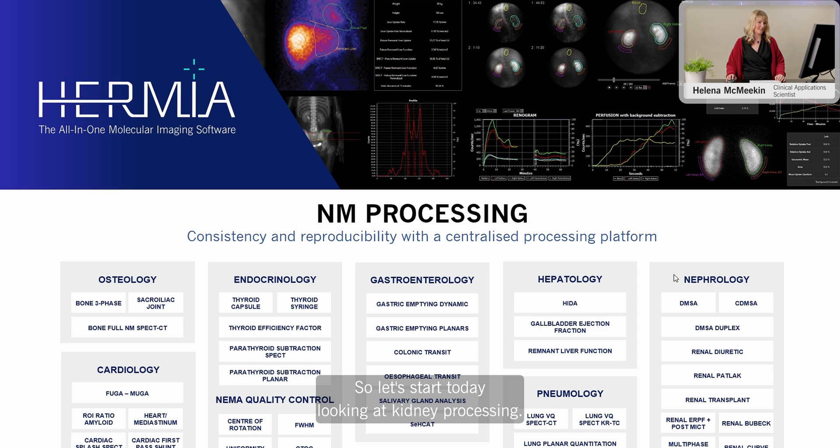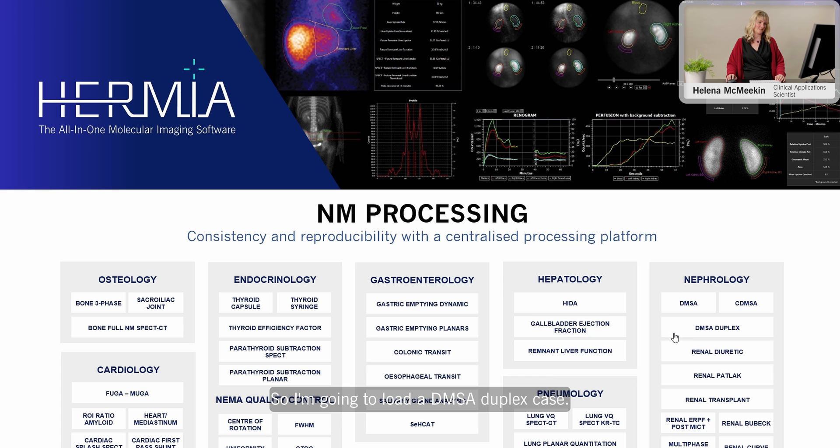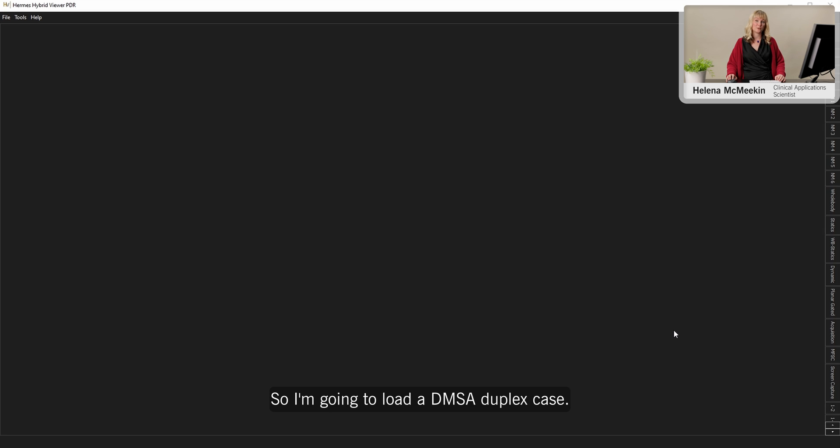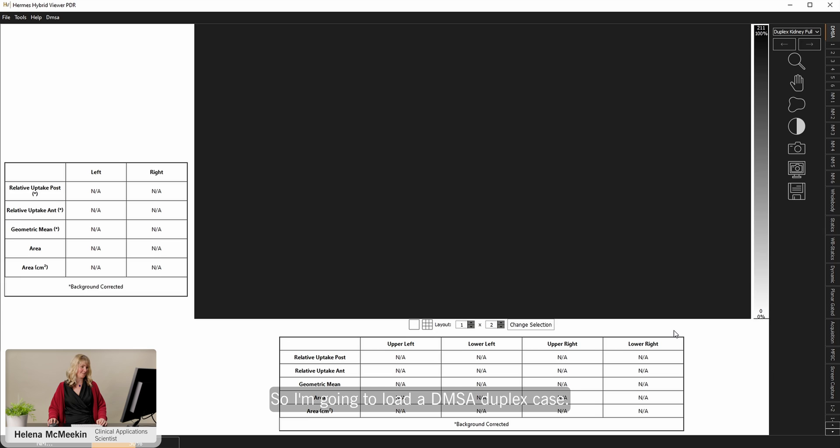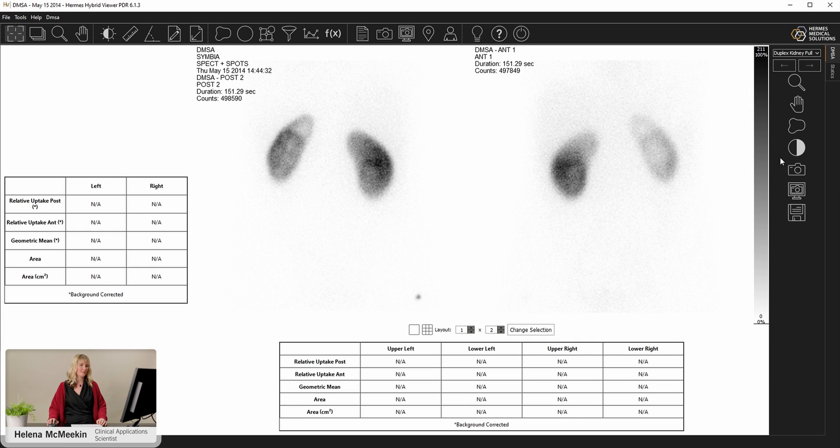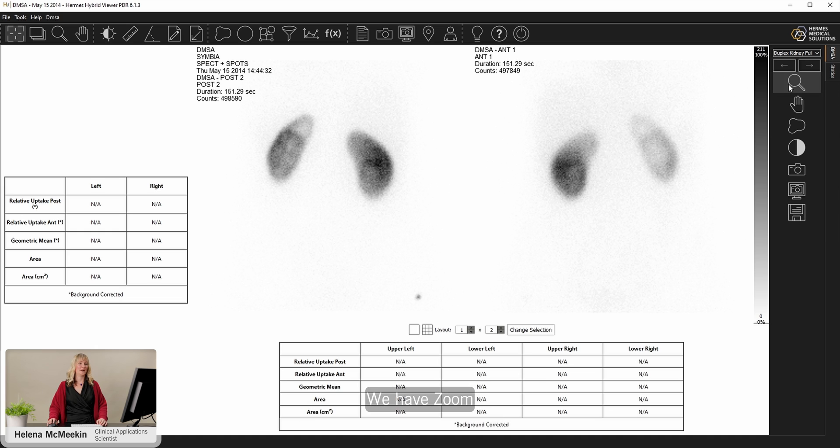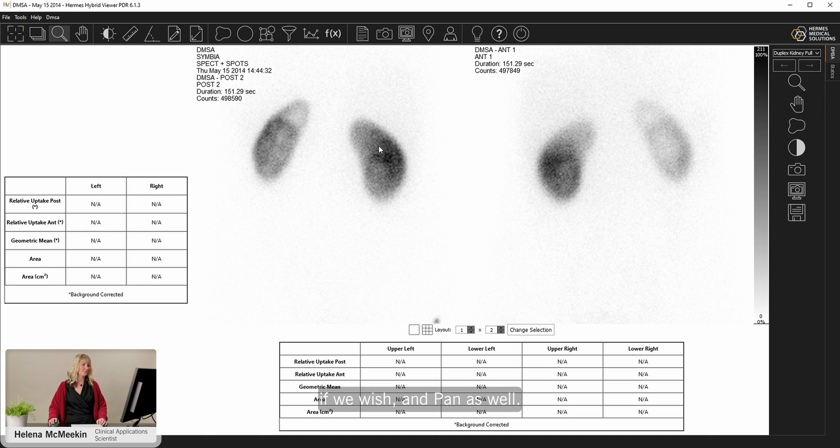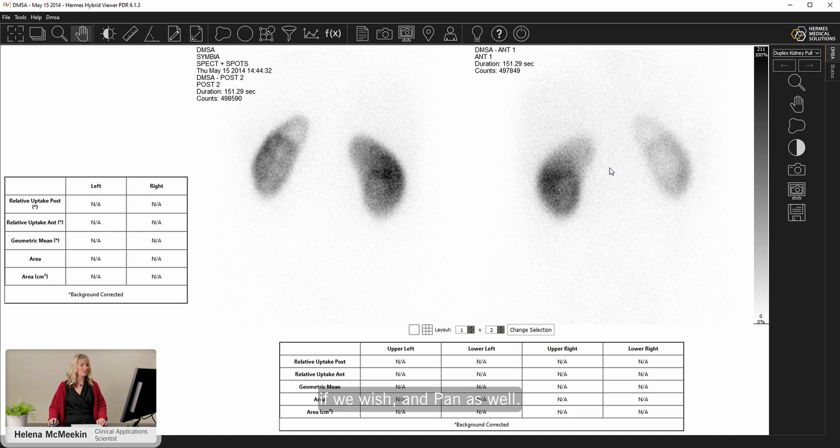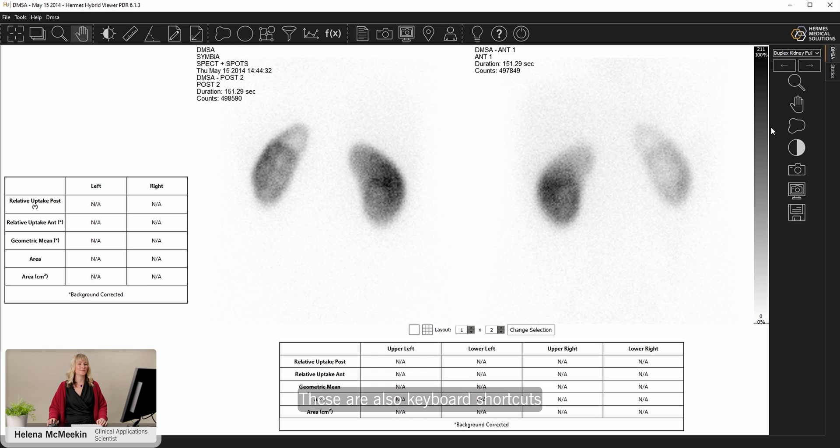So let's start today looking at kidney processing. I'm going to load a DMSA duplex case. The processing tools all start from down the side here. We have zoom, if we wish, and pan as well. These are also keyboard shortcuts.